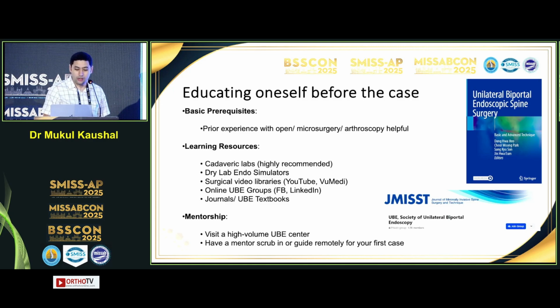It's very important to attend a lot of cadaveric labs, get to understand the nuances of the optics, the camera and your instruments, develop hand-eye coordination, and understand the concepts of orientation and triangulation. In your OPD also, you can keep bone models in a closed cardboard box, make punctures and try to orient in a dry lab in your own OPD setup. There are a lot of surgical video libraries. Join UBE groups. There are a lot of UBE groups on Facebook and LinkedIn.